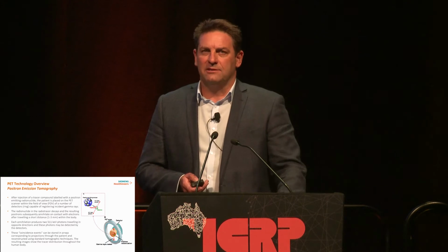The other thing to note here is that PET scanning is about 90% of the time used for oncology imaging, and the remaining 10% is made up of cardiac and neurology imaging at the moment.